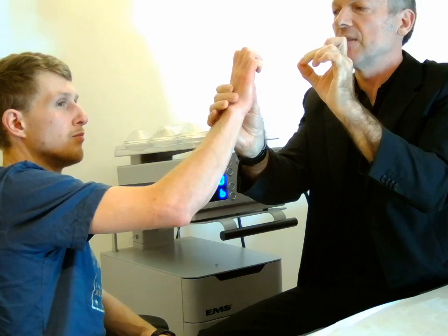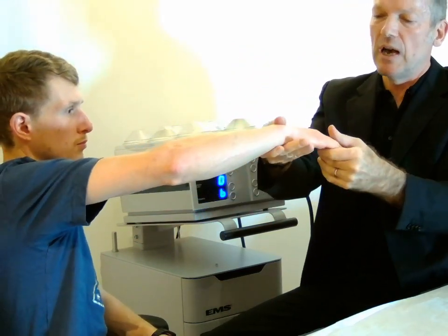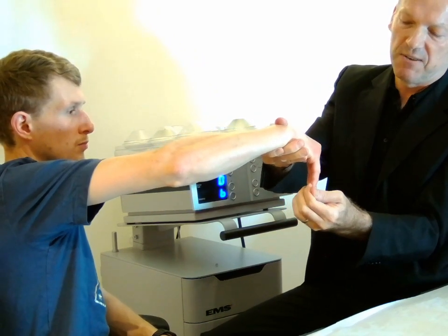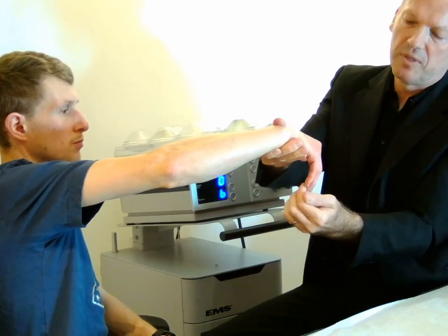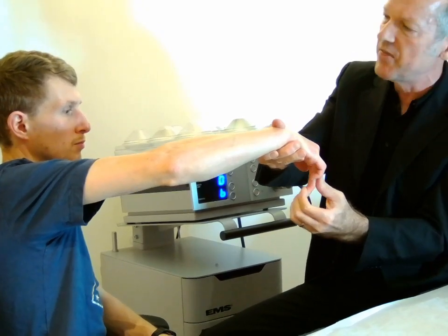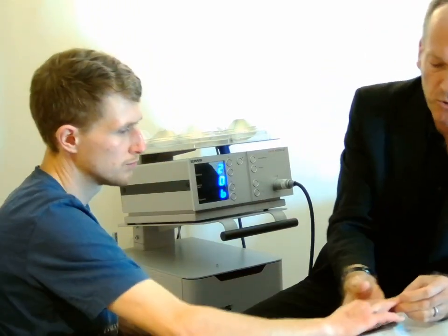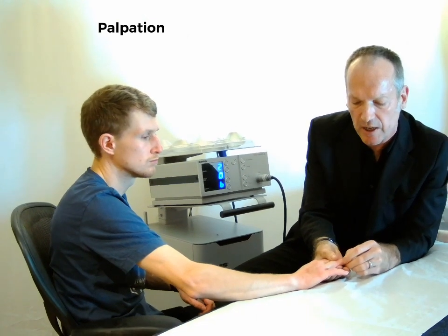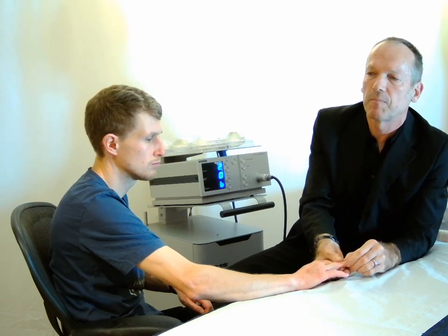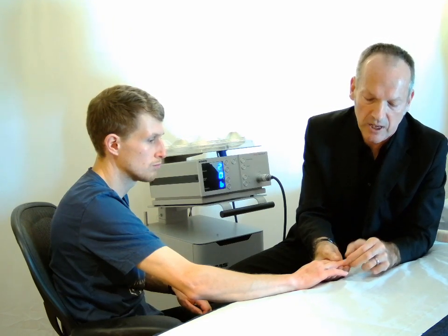That is significantly better. Now the other position that I tend to test in is with the arm out straight, and then pull. So we're testing finger flexion with the MCP at 90 and the others in neutral and hold, and that was failing day 1 and there was significant pain. Obviously palpatory assessment, the palpation over the area, and I'll normally have the palm down to feel, and this is all supported by ultrasound scanning, so I'm a MSK sonographer.